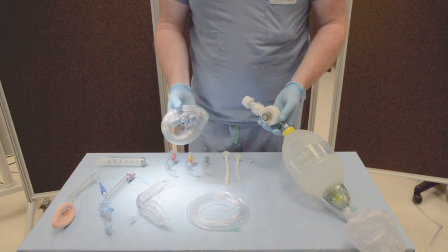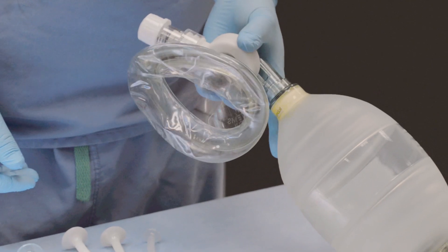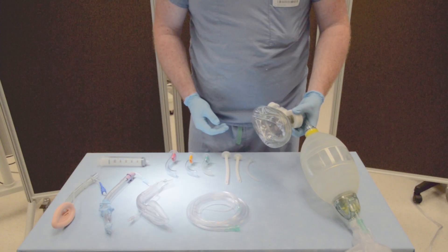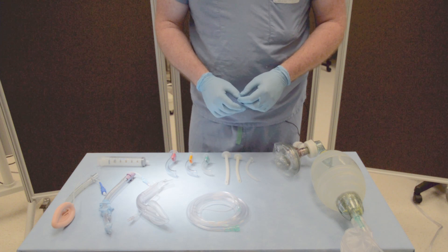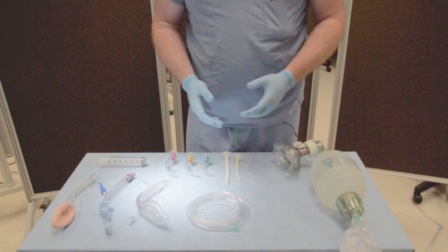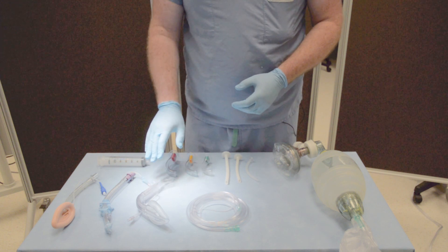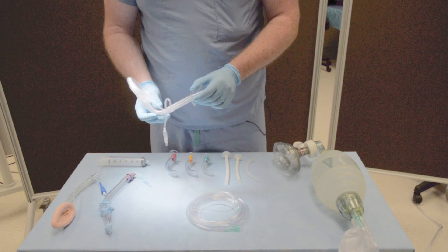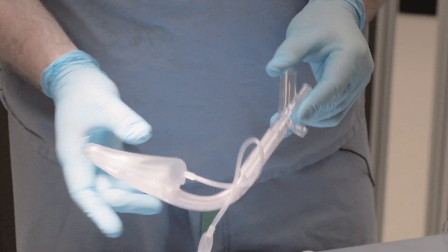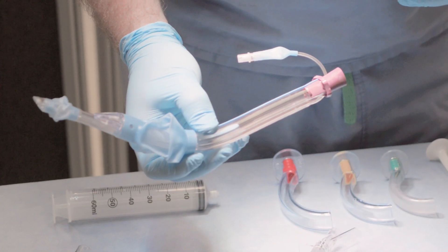A tight-fitting mask then connects to your bag mask ventilator and is held to the patient's face with two hands to ensure an appropriate seal. Some additional equipment if difficulty is encountered with non-invasive oxygenation and ventilation includes extraglottic or supraglottic devices. Common ones include the LMA Supreme, or more commonly used in a pre-hospital environment, the King LT.